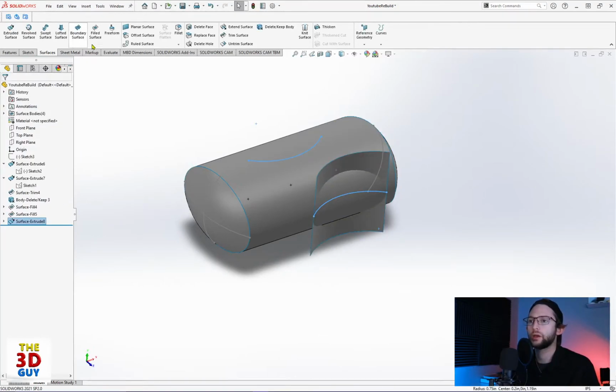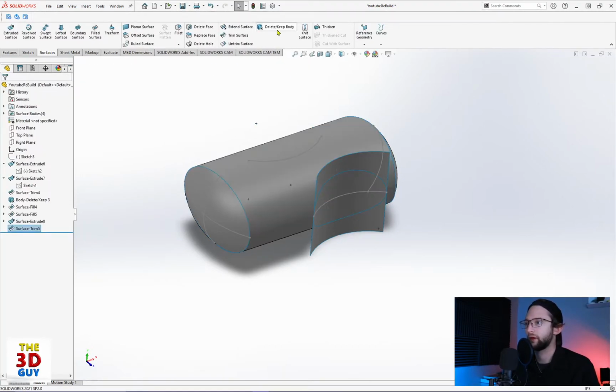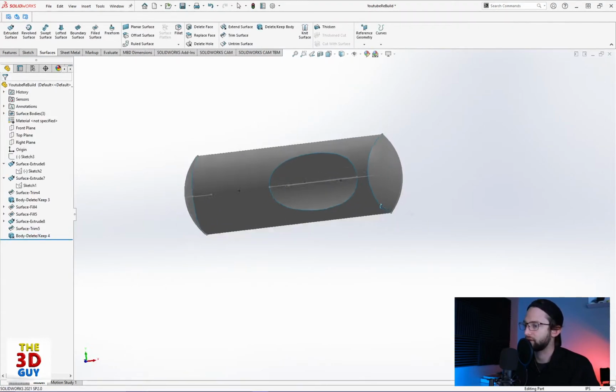Click OK. And we're just going to do the same sort of thing. We're just going to trim that out and delete this body. And you can see, boom, got this little cutout.